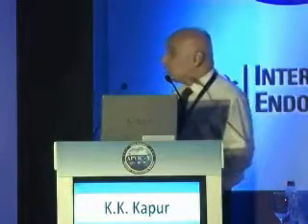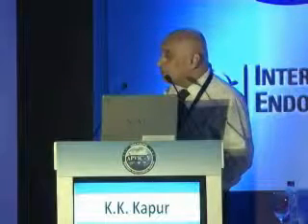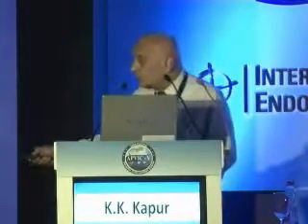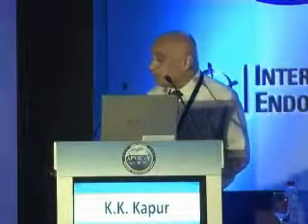Now, of course, you can have the dual popliteal vein. You can see this popliteal vein is not obliterated. It's not showing any spontaneous flow, but the other popliteal vein next to the artery is showing spontaneous flow. So if you get flow here, it does not mean that there is no DVT. There could be an additional popliteal vein. There could be a dual popliteal vein.